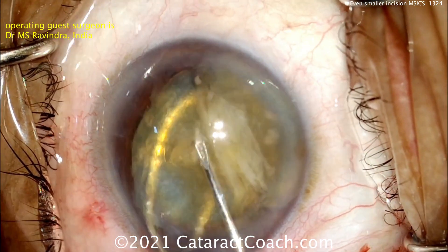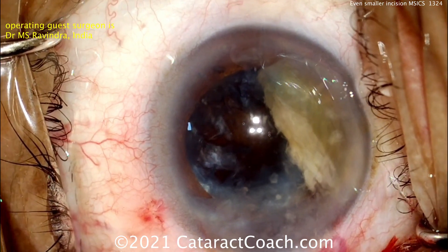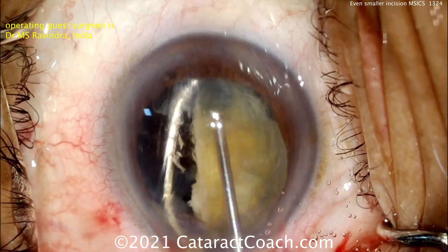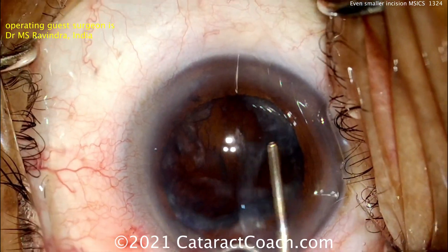Fantastic. Now a little bit of traction — pull that one piece out. Notice how he's careful not to let the piece scrape against the endothelium of the cornea. A little more viscoelastic. There's the second piece — lens loop on the bottom, cannula on top. Bring that right out. Beautiful technique.